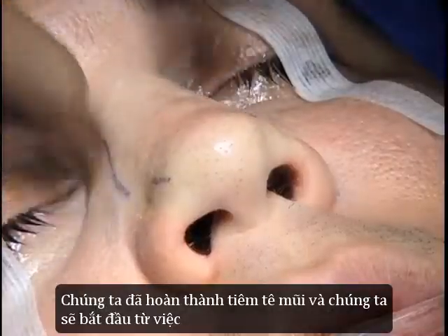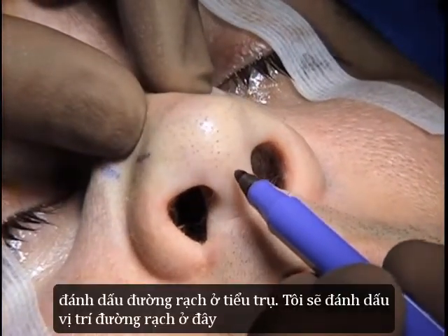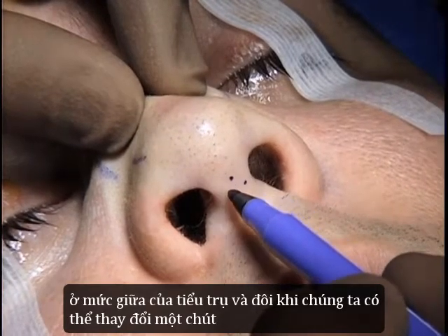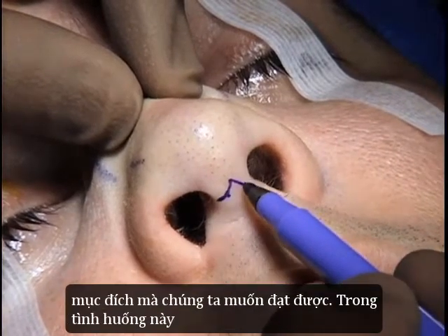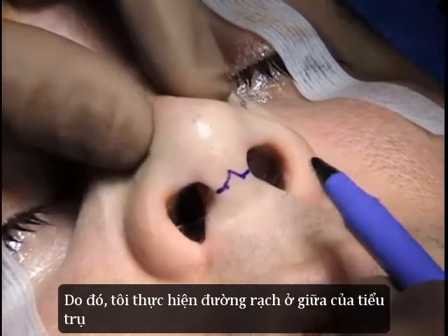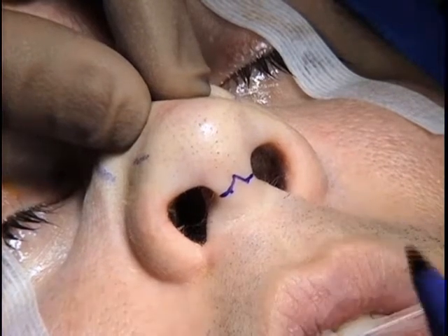We've already injected the nose, and we're going to begin by making a mid-columellar incision. So I'm going to mark the incision out here at the level of the mid-columella. Sometimes we alter the position of this incision based on what we're trying to accomplish. In this situation, we're going to try to increase this projection. So I just place it in the region of the mid-columellar level.